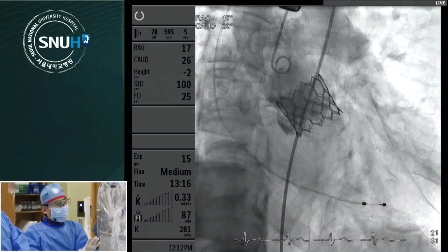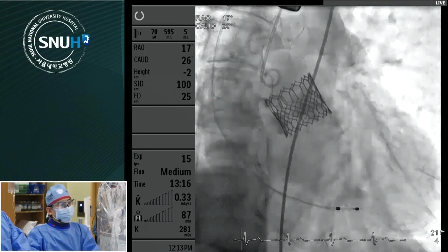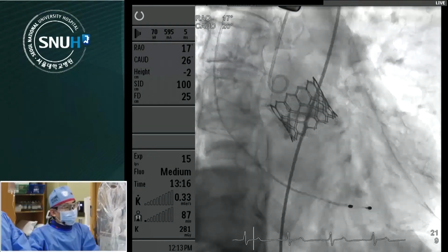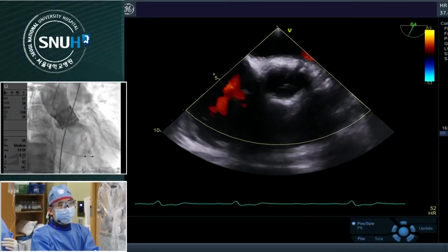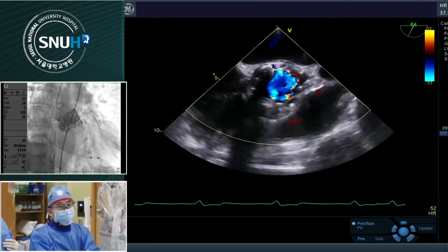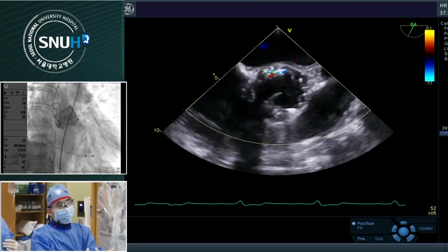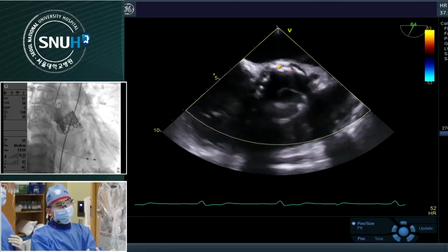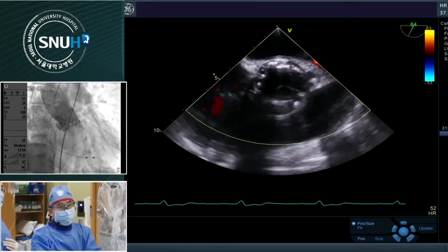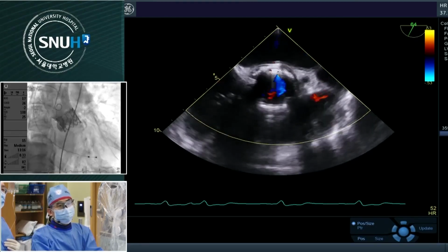If the patient has not LBBB and the oversize index is just 10%, how do we do? Adjunctive ballooning? In our analysis, Dr. Junbin Bak submitted a paper. The message is like this. If the calcium is concentric, we can cure it with additional ballooning. But if calcium is very eccentric, leakage cannot be improved by additional post-ballooning.